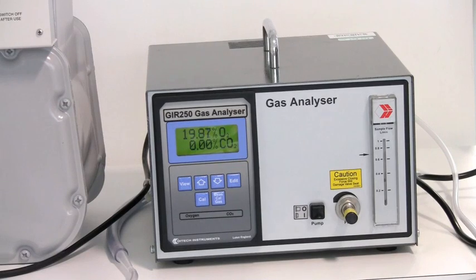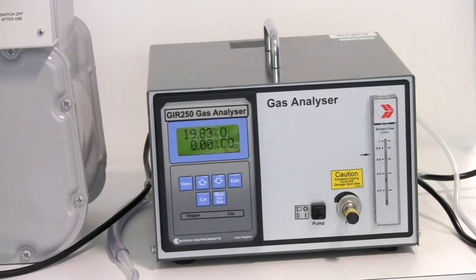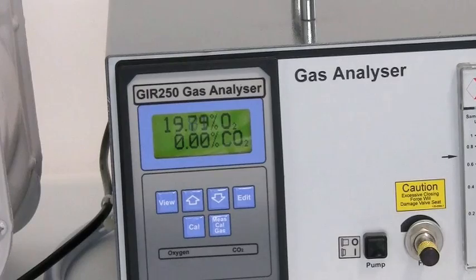Make sure the pump for the analyser is on, and then after about two minutes the oxygen and the carbon dioxide values should have changed. Once they've stabilised, you should record these values.